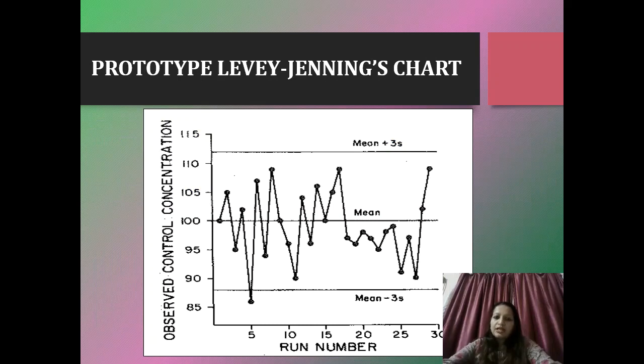Based on the concept of random and systematic error, we have a few rules known as the Westgard Rules, which we'll come to later.